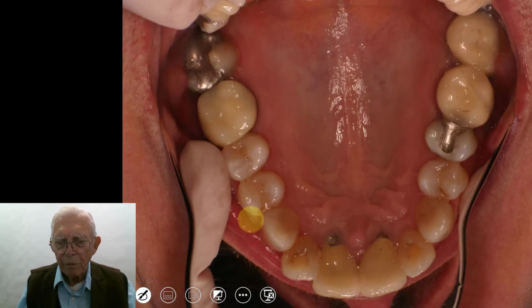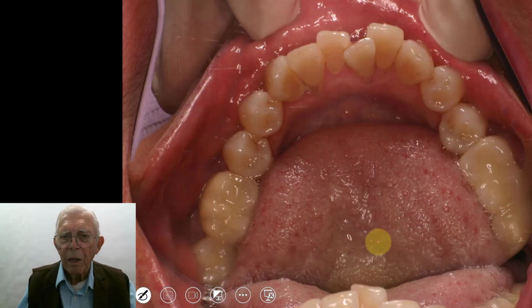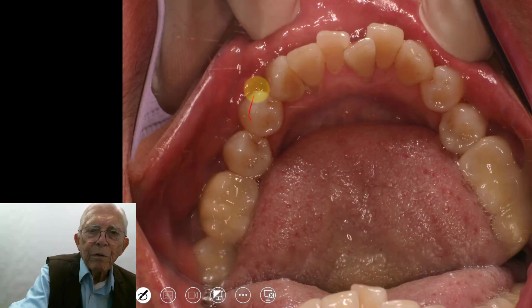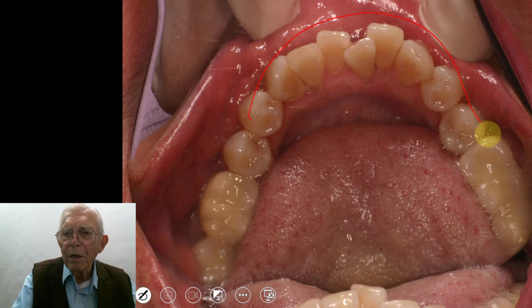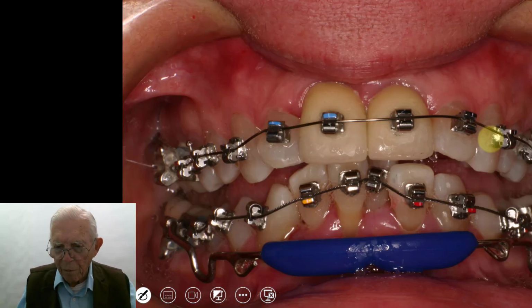And up above, she looks like she's got some crowns on those teeth, and the basal part of the crown showing out here. Now down here, we're going to have to bring these teeth out, and we're going to have to run interference for them. So here's what we do. You can make your own lip bumper, or you can get one that fits into your headgear tube in here.